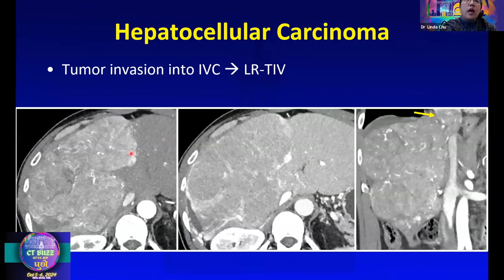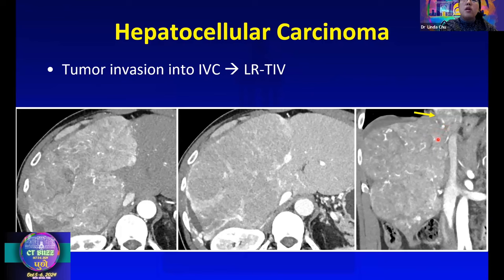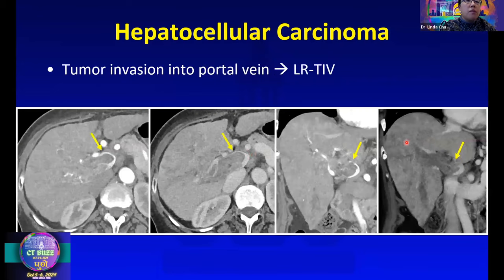Here's an example of the LR-TIV category, with a very heterogeneously enhancing infiltrative-looking mass on arterial phase and washout on venous phase. On coronal images, this mass is directly invading the IVC — that's why it falls in the LR-TIV category. Arterial phase images are helpful in distinguishing tumor thrombus from bland thrombus, because tumor thrombus will enhance on arterial phase. In a second example, the portal vein is expanded with a filling defect that shows enhancement on arterial phase, confirming tumor thrombus rather than bland thrombus.